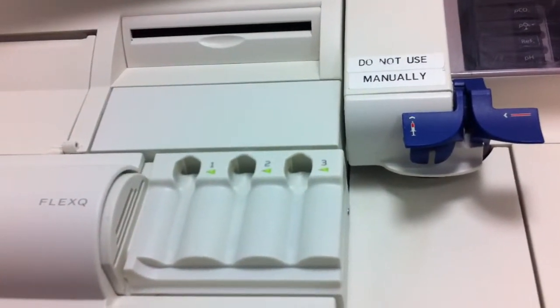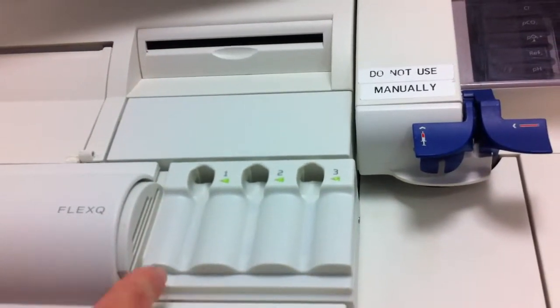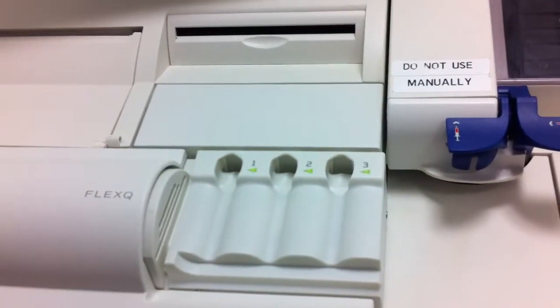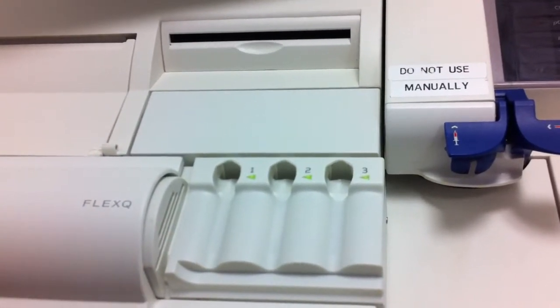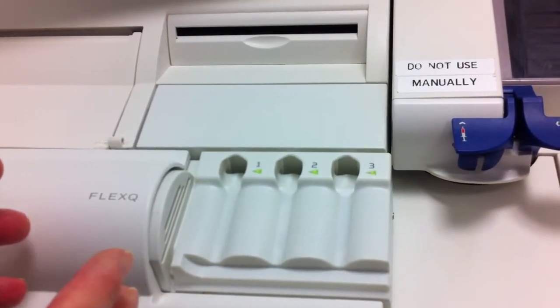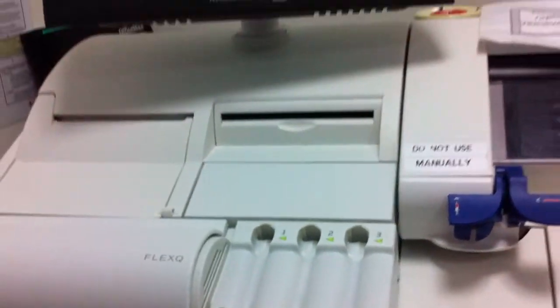There are three positions, so three blood gases can be put on at once. The green light means that the port is available and ready to be used. If the light was amber and there's a syringe loaded on there, that would indicate that that sample's in progress and you can't interfere with that particular sample. That's all we'll cover for this video — just a few bits and pieces about how the radiometer machine works. You'll be able to link this video to the others of processing a sample and then the bedside procedure for how to take the blood from a radial arterial line.